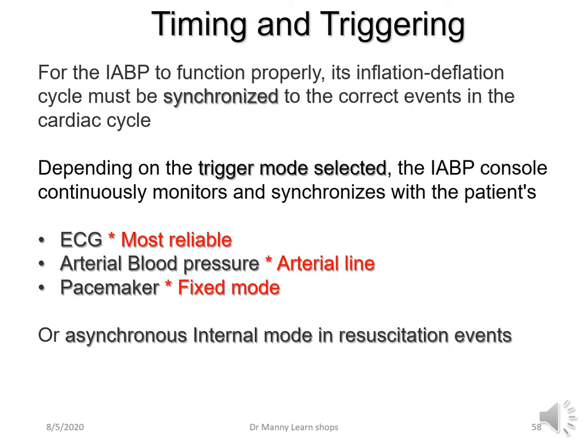Now let's look at timing and triggering and understand the concept. For the IABP to function properly, its inflation and deflation cycle has to be synchronized to the correct events of the cardiac cycle. That's why we looked at the blood pressure waveform. The aortic end-diastolic pressure, the beginning of systole, and the dicrotic notch, closure of the aortic valve.